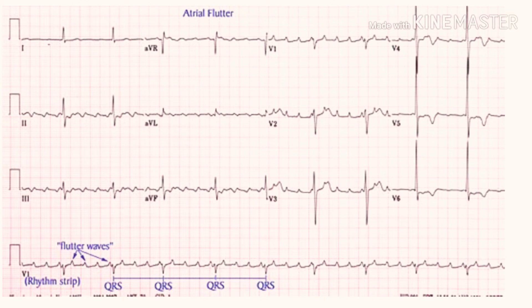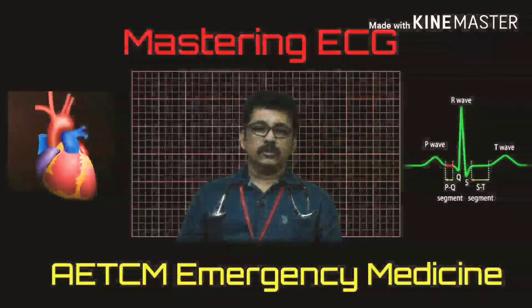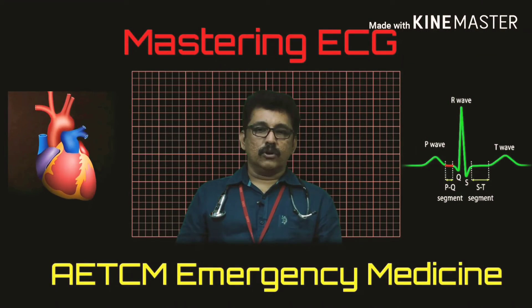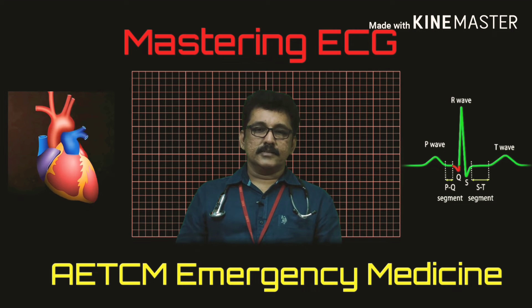Impulses traveling in a circular course inside the atria produce atrial flutter. In this ECG, you can see four P-waves then one QRS complex, again four P-waves then one QRS complex — this sawtooth pattern is classically seen in atrial flutter.